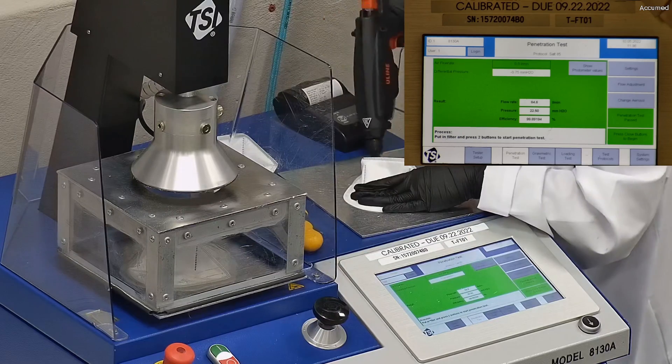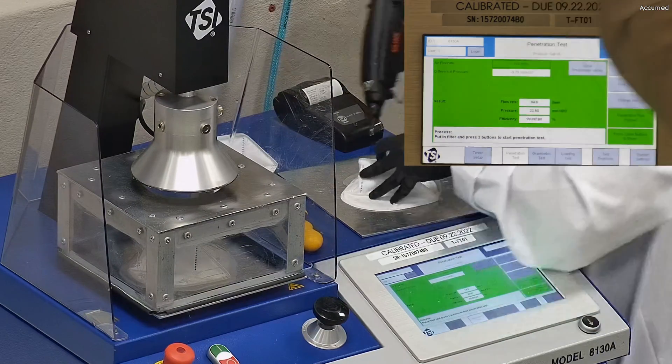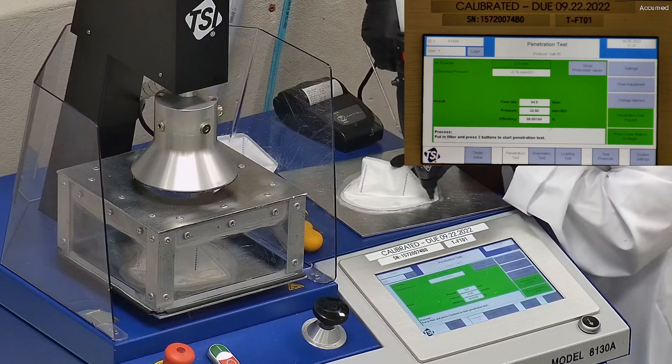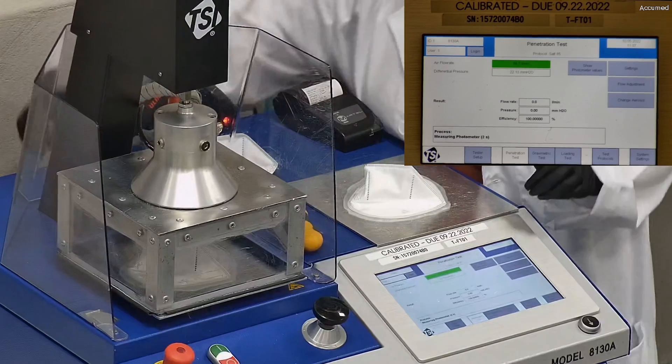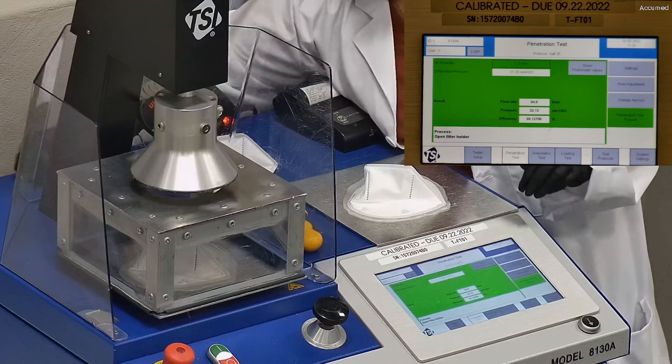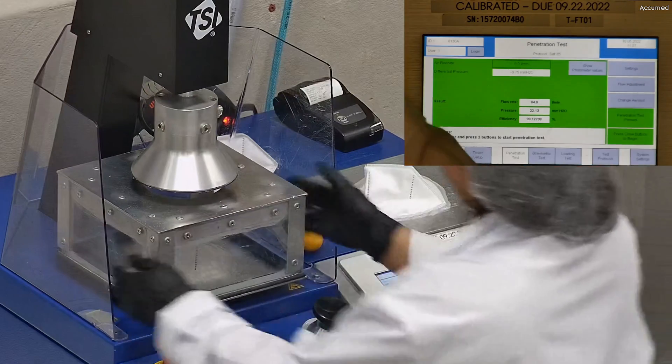The results are displayed on the TSI monitor. F stands for air flow rate, which we test at 85 liters per minute. R is for resistance, also referred to as pressure drop. This correlates with the breathability — so the lower the number, the more comfortable and breathable the mask or respirator is. E stands for filtration efficiency percentage.